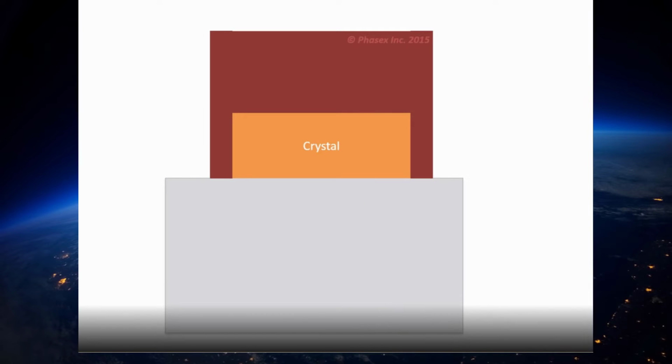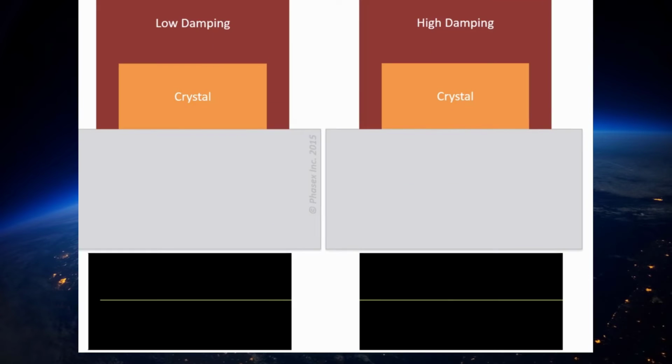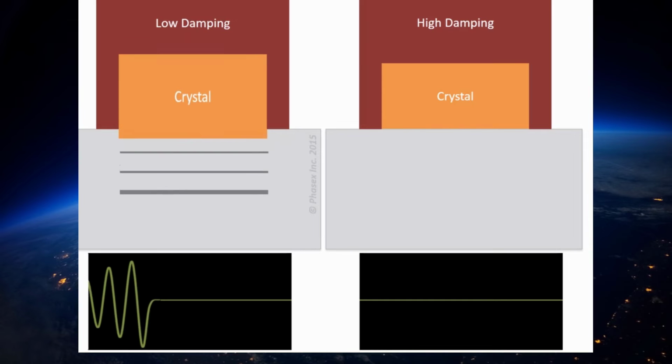Backing material is one of the most important components of the ultrasound transducer, and in its assembly is applied in and around the piezoelectric crystals. The PZT crystals vibrate in response to stimulation. Now let's see what happens when there is vibration with or without significant backing.